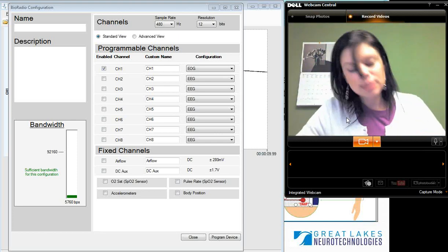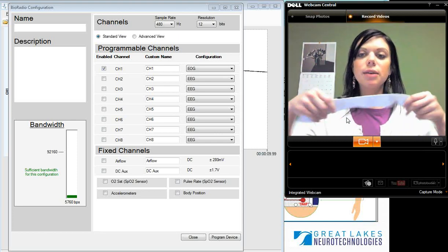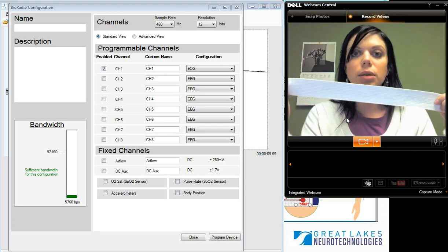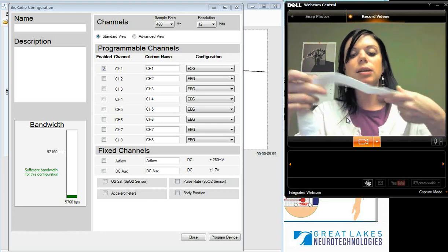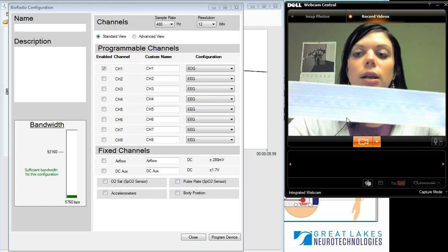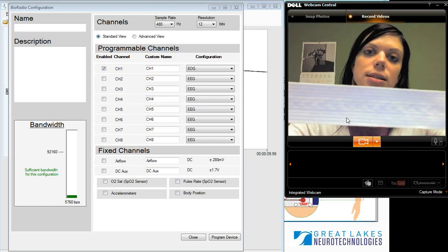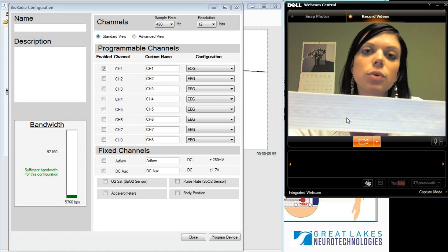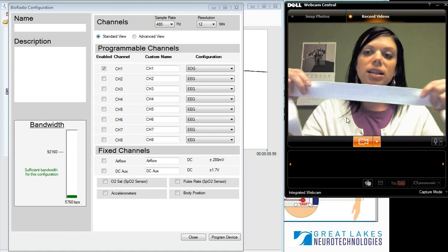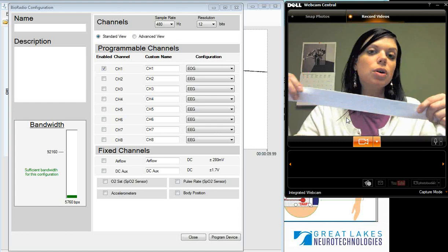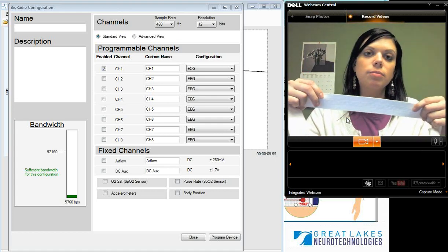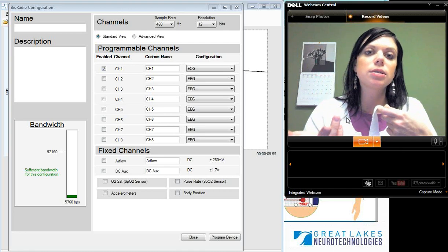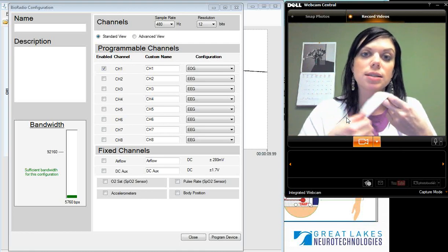Next is the RIP belt itself. This is what a RIP belt looks like — it's elastic, as I mentioned, and goes completely around the chest and the abdomen. If I hold this closer, you might even be able to see the coil going through the center of the belt in a sinusoidal form. As the belt expands and contracts, that's what causes the current being applied to be transformed into the respiratory waveform you're going to see on the screen.